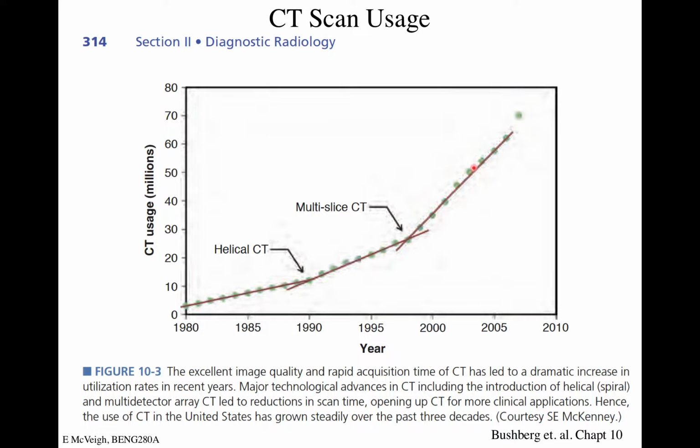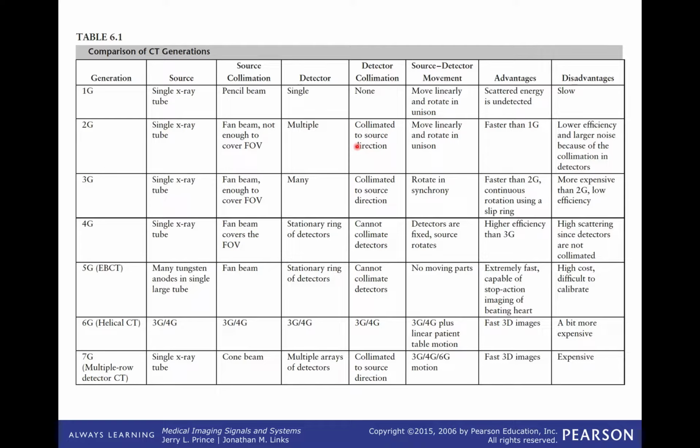To have one of these at the front of your hospital, in radiology, patients go through this thing, and you just know what's going on by the time they get out of that scanner, right? Because there's no motion artifact, all this stuff. So it's a great product. And everybody followed suit. Every vendor went to these larger slice counts, and so the number of scans just became fairly large.